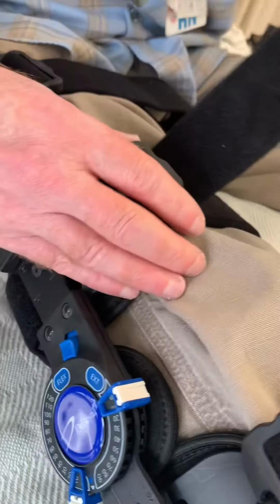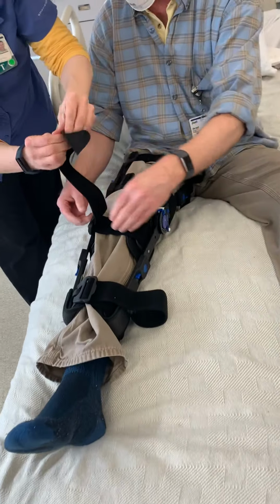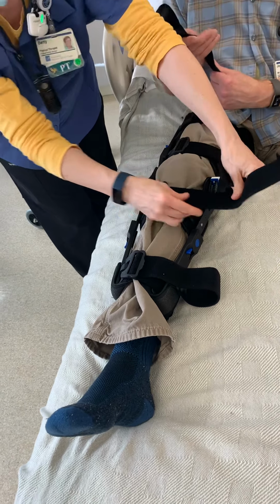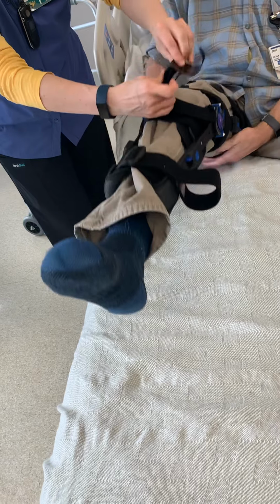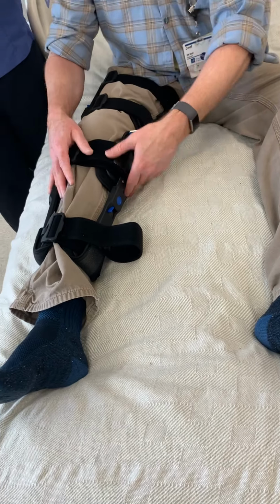So it's a pretty slick brace. I mean, it's really nice for the patients to be able to do. Now you notice the straps are 1.5 miles long. Right. They have the ability to be undone and cut. So if you got somebody with a thinner leg and you only need that much strap, you can cut that sucker off and put the Velcro back where you want it. Oh, say this comes off, yeah. So you can do a lot of tailoring to it.